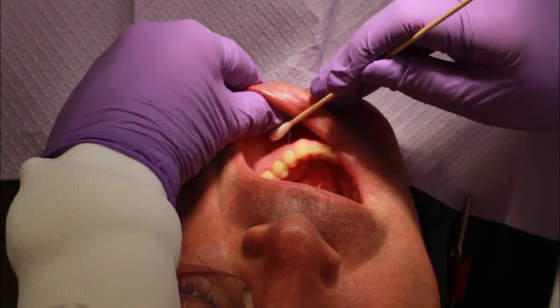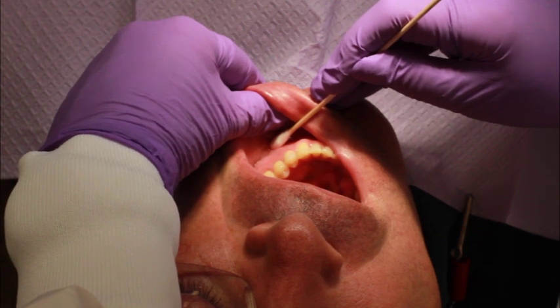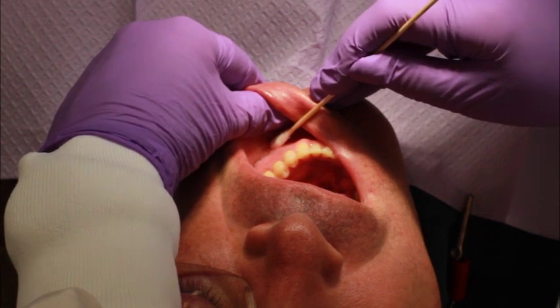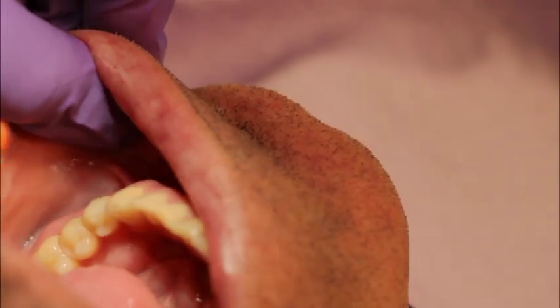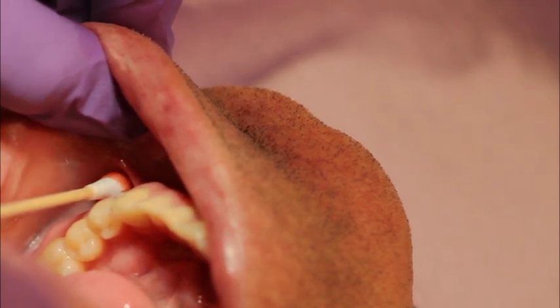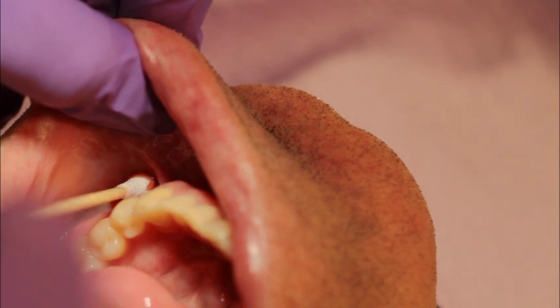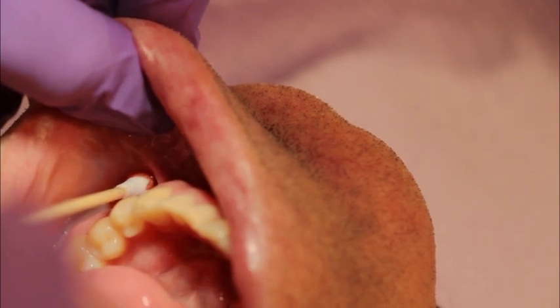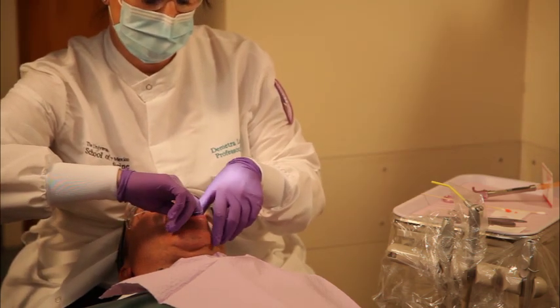Ask the supine patient to open the mouth and retract the lower lip outward, pulling the tissue taut. You may use a piece of sterile gauze to help retract slippery tissue. Locate the mental foramen, which is usually between the apices of the mandibular premolars. Dry the penetration site and prepare the alveolar mucosal tissue with topical anesthetic anterior to the mental foramen in the depth of the mucobuccal fold. Topical anesthetics are most effective for patient comfort when applied for 1 to 2 minutes. Dry the tissue to remove any excess topical anesthetic.